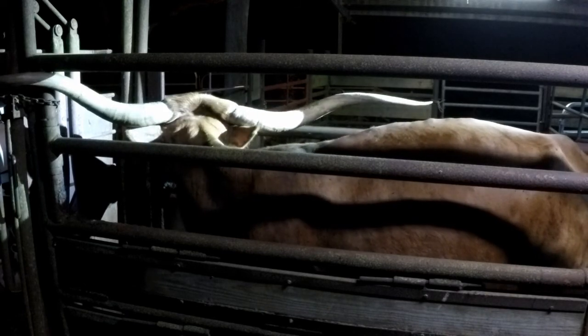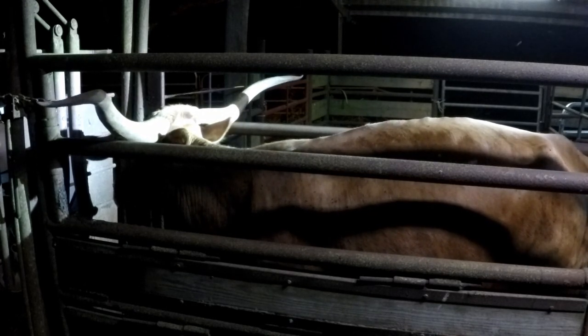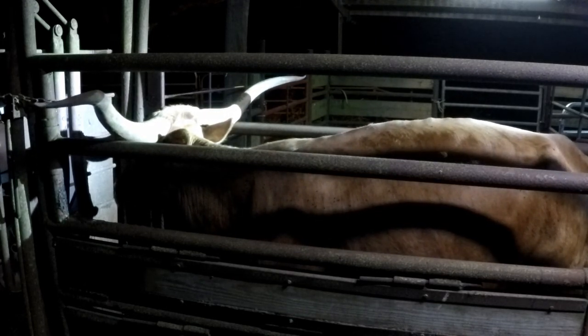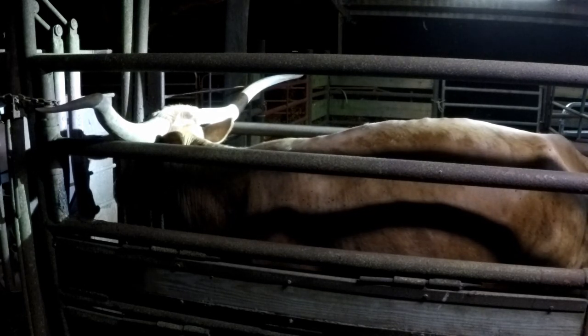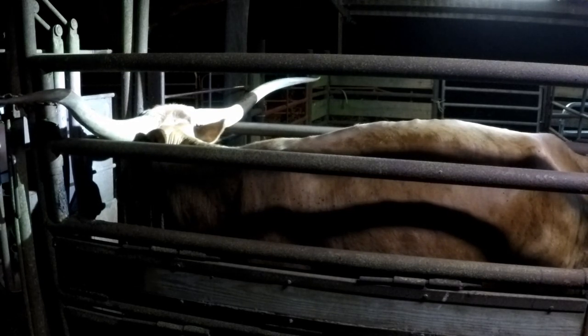I'm having to push it forward because she's just laying back on me. So, I've got the cervix in my hand, but I don't have the gun to the entrance. There it is. Now, moving up onto the cervix past the entrance. Oh, she pushed it out — right back in.